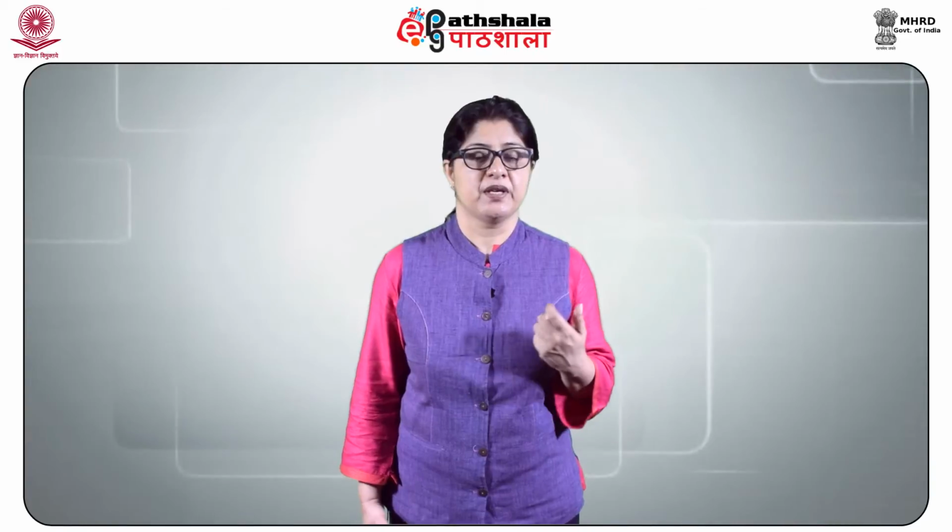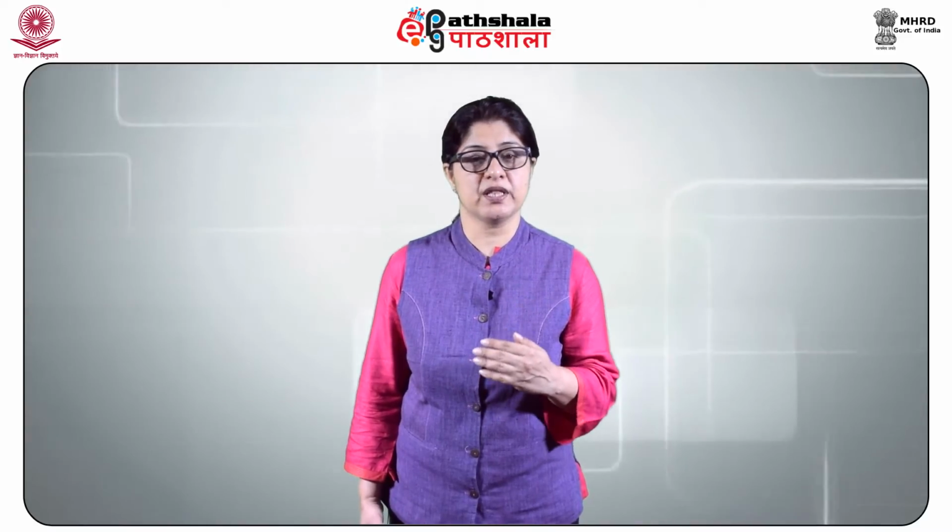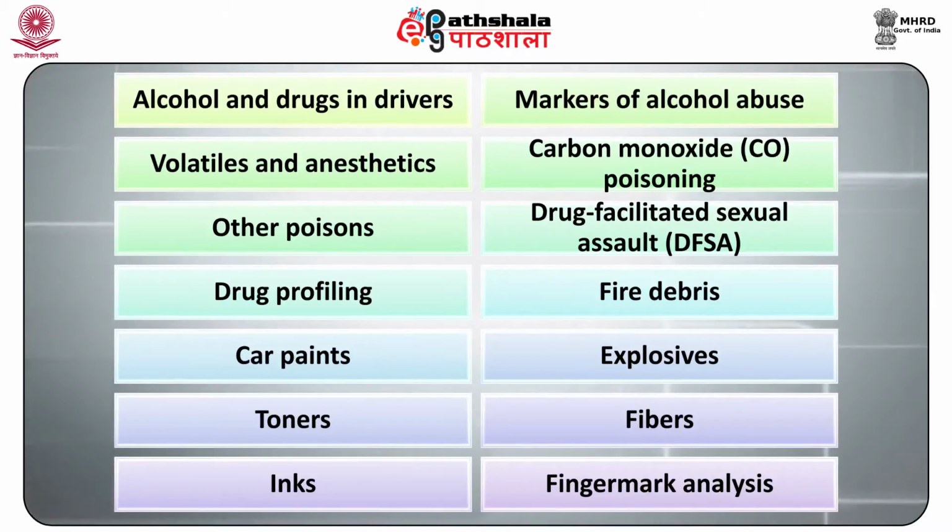and recent applications of GC in the forensic sciences, including those in forensic toxicology, which include alcohols and drugs in drivers, markers of alcohol abuse, volatiles and anesthetics, carbon monoxide poisoning, poisons, drug facilitated sexual assault and drug profiling, and more general applications to criminalities in areas such as fire debris, car paints, explosives, toners, fibers, inks and fingermark analysis.